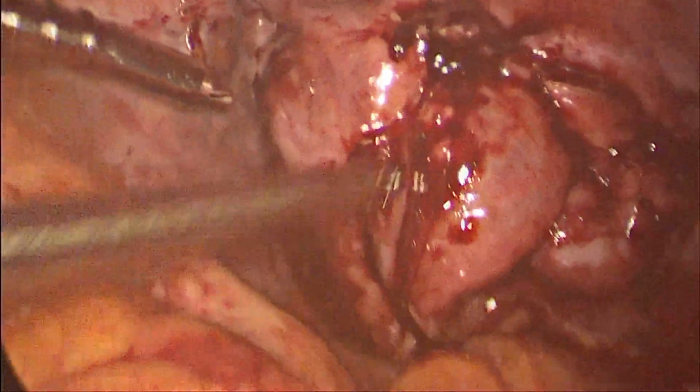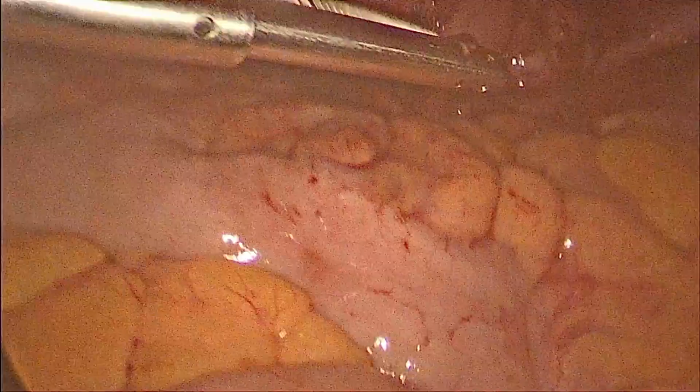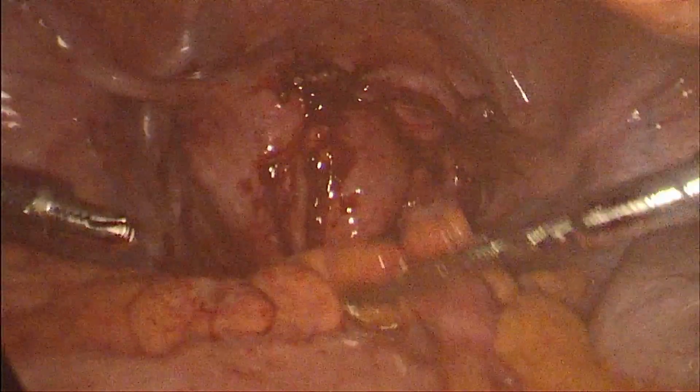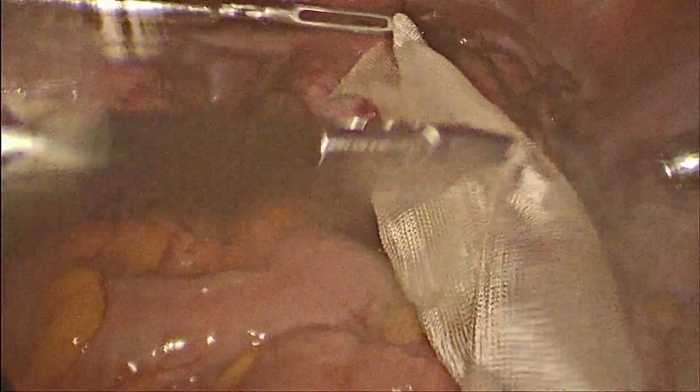Similarly, anterior fibroids were also removed and hemostasis achieved. We can see the vascularity of the uterus, which is now turning pink in color, and there is no oozing of blood through the incision, which once again confirms good hemostasis.